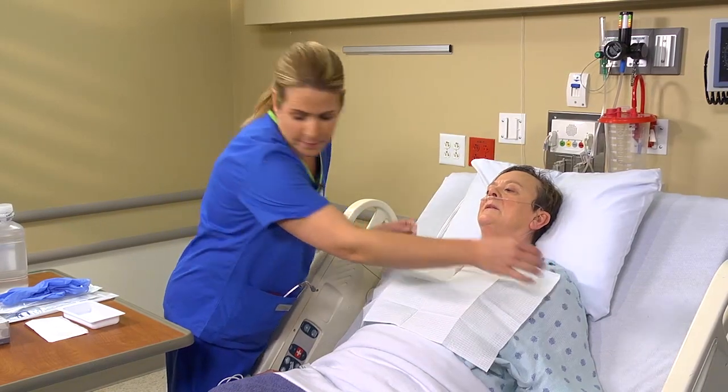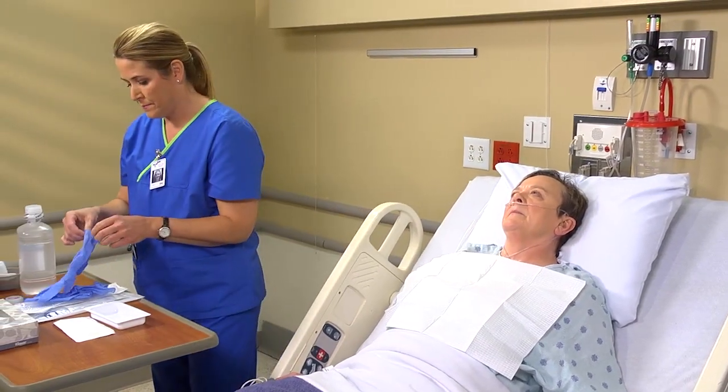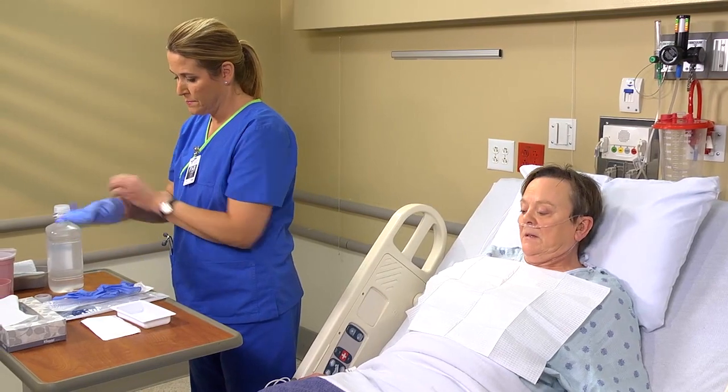Drape her neck and chest. Put on gloves and use a mask, gown, and face shield if splashing is likely.